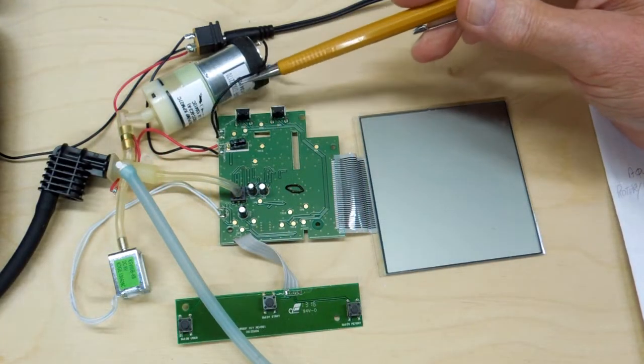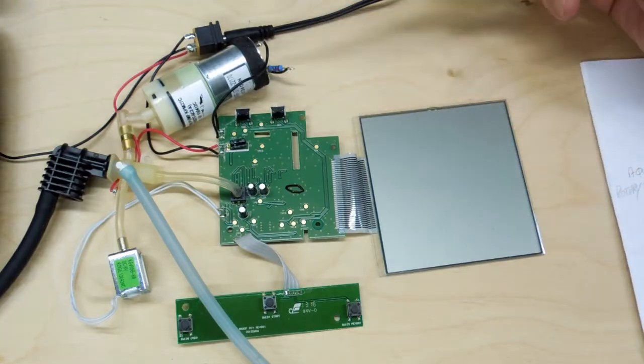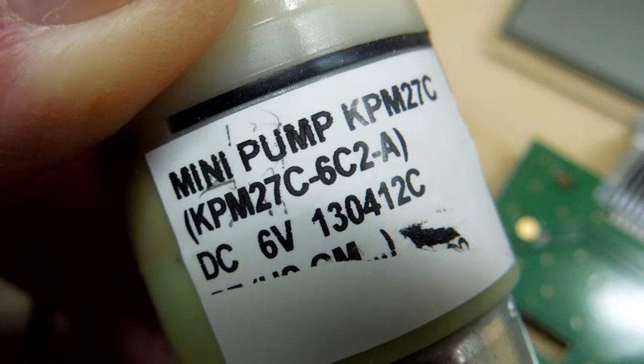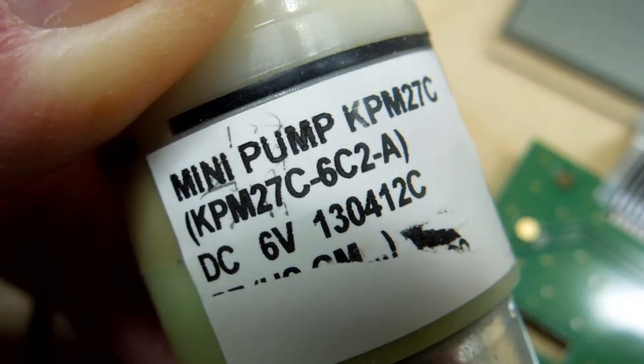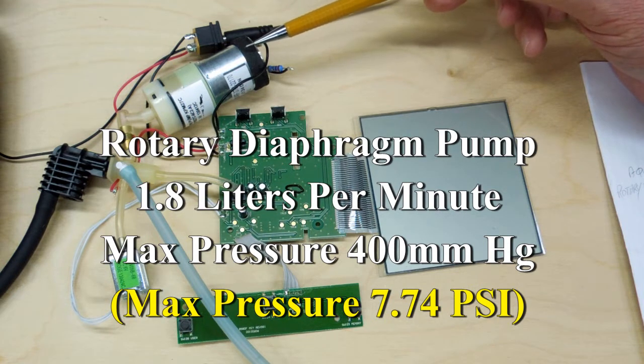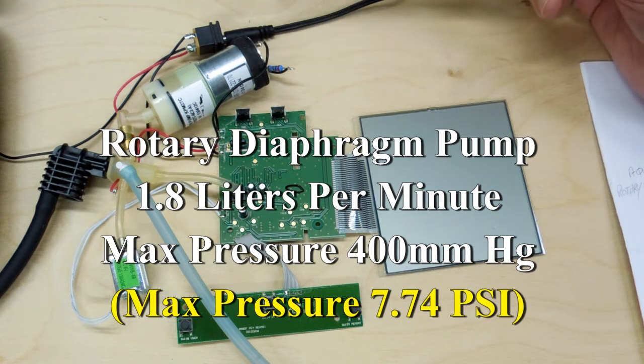Surprisingly, doing a Google search on this part number, you'll find out that this is a rotary diaphragm pump that delivers 1.8 liters per minute and a maximum output pressure of 400 millimeters of mercury, which is about 7 and three-quarter PSI.